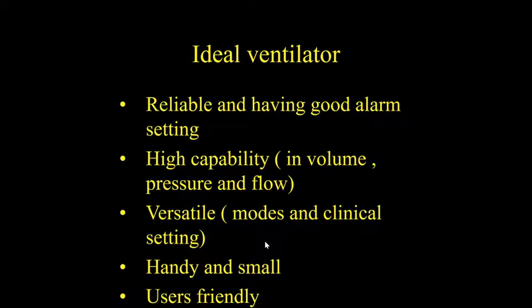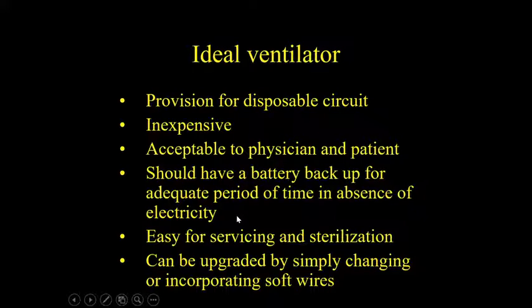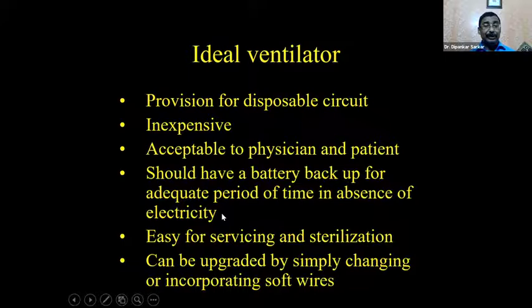Provision for a disposable circuit should be there. It should be inexpensive. That is the bottom line. Even if you use it, it should not spend too much. Acceptable to the physicians and the patient, it should have a battery backup.